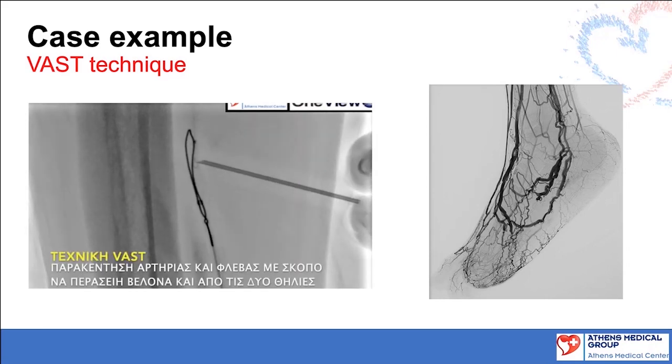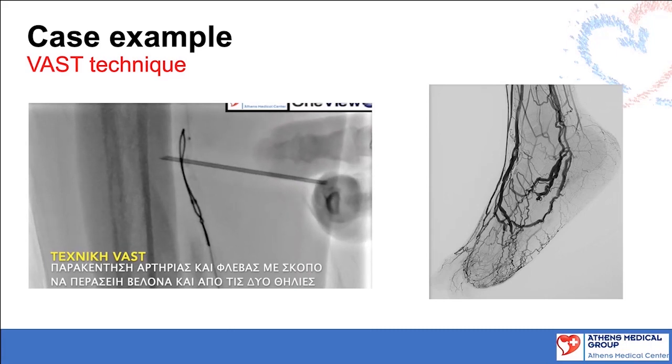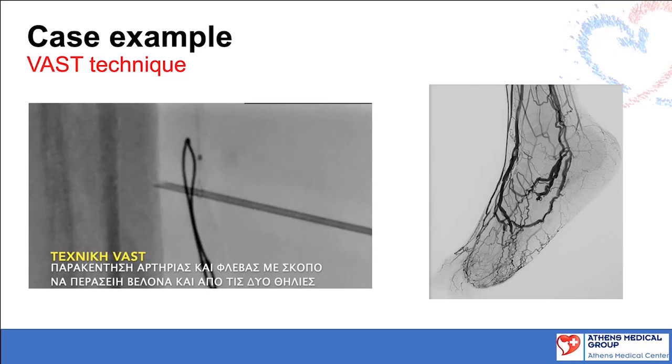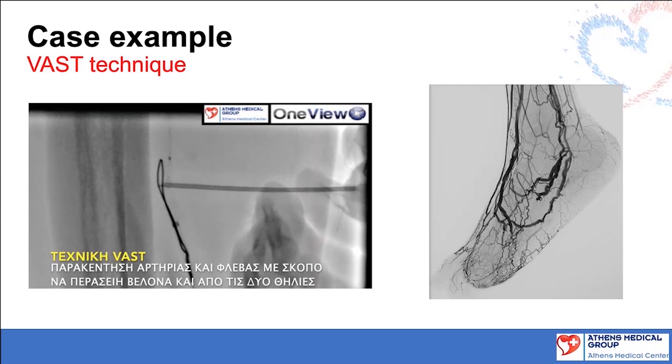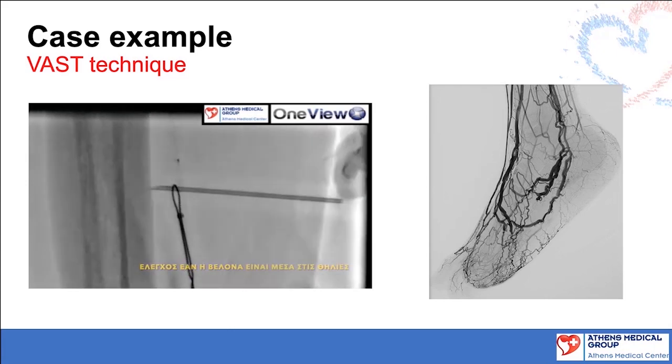This is the technique where you are changing the nature of the distal veins from veins to arteries. That means you're doing a venous arterialization, using the veins as a way to bring arterial blood into your forefoot.